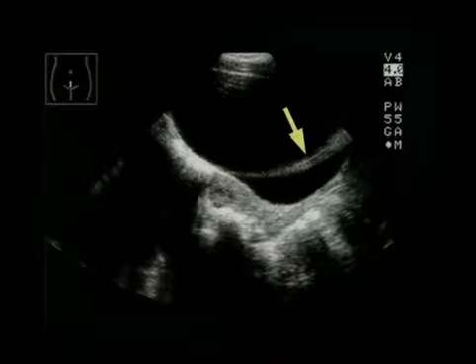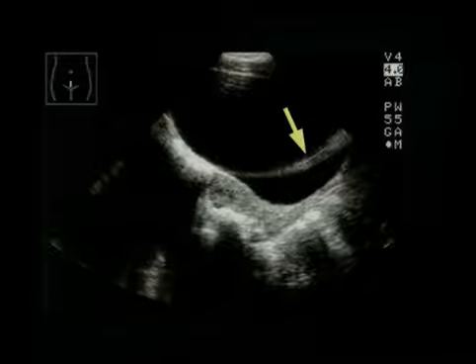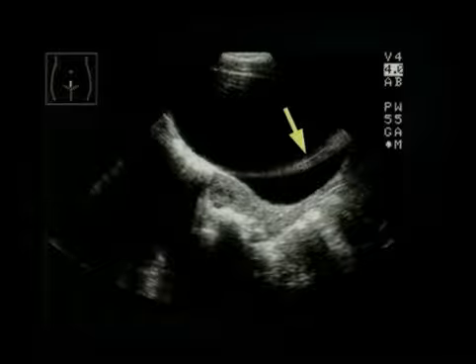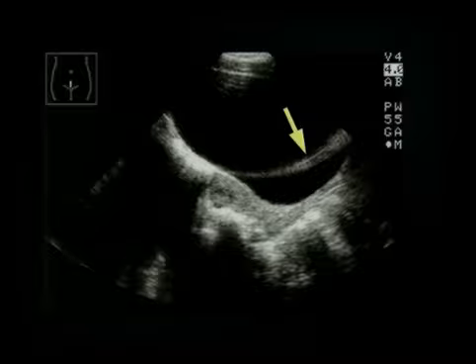The arrow here points to an artifact projected over the distended bladder in a pelvic ultrasound. This side lobe results from the interaction of the acoustic field of the transducer off-axis with gas in adjacent bowel within the female pelvis.